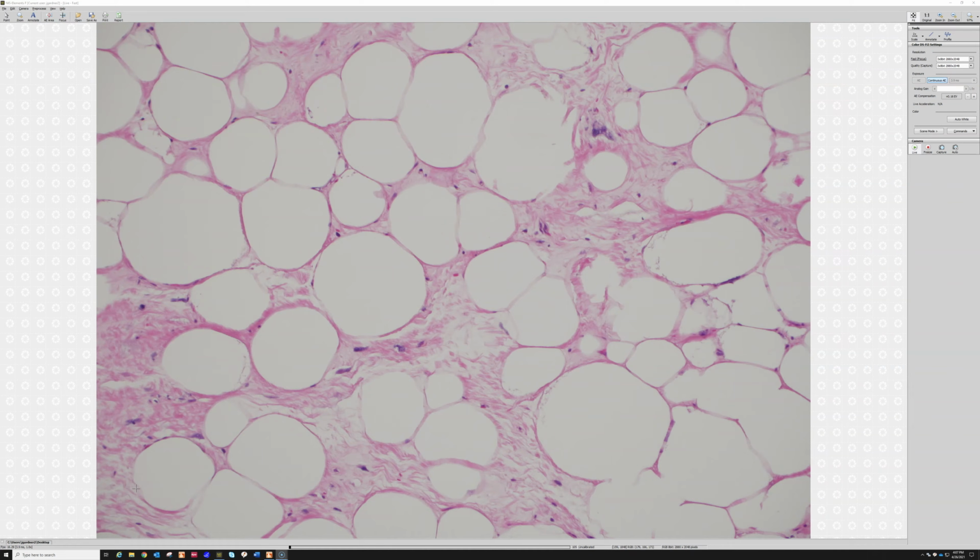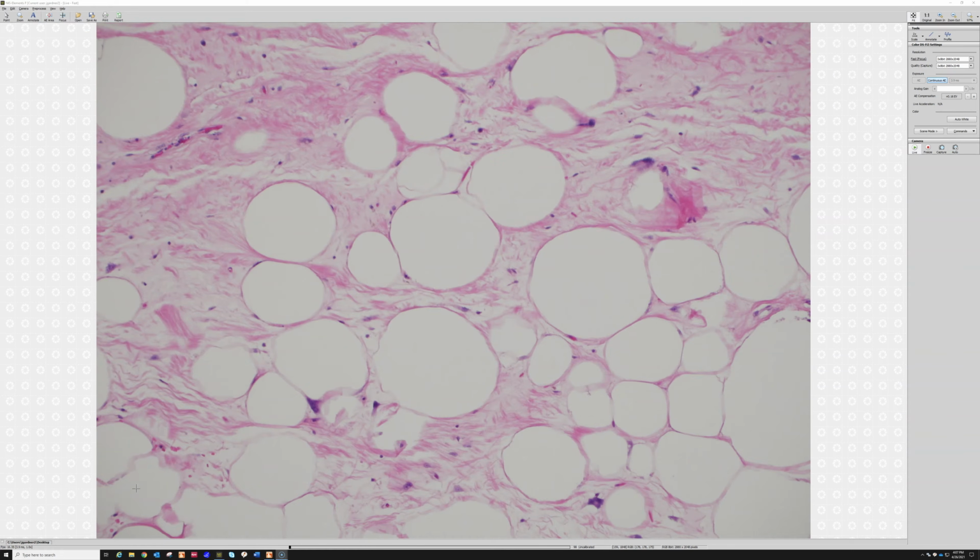Now, it can be seen in some other tumors like intimal sarcomas, cardiac sarcomas inside the chambers of the heart, also low-grade central osteosarcoma, which is weird. Like, why do those tumors that are totally unrelated to well-diff liposarc, why do they have MDM2 amplification? Who knows? Molecular answers some questions for us and then opens up a whole bunch of new ones that we don't have full understanding of yet.